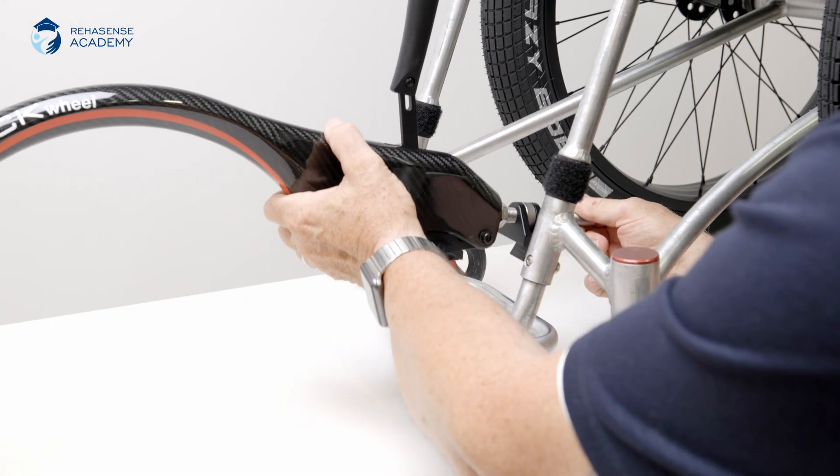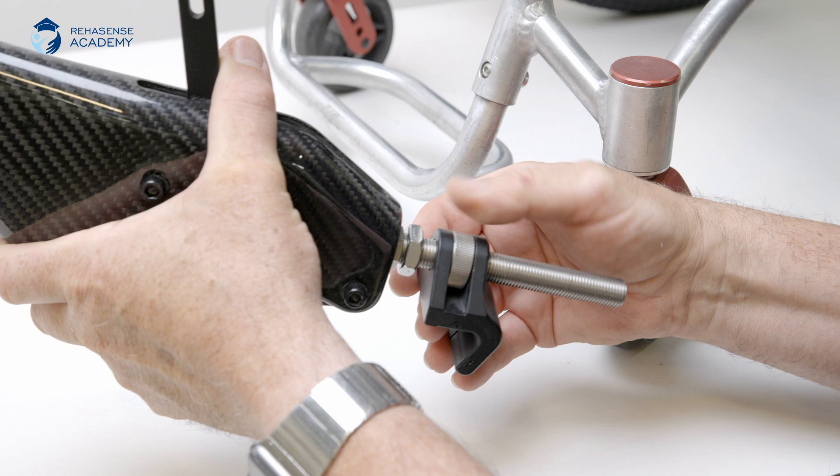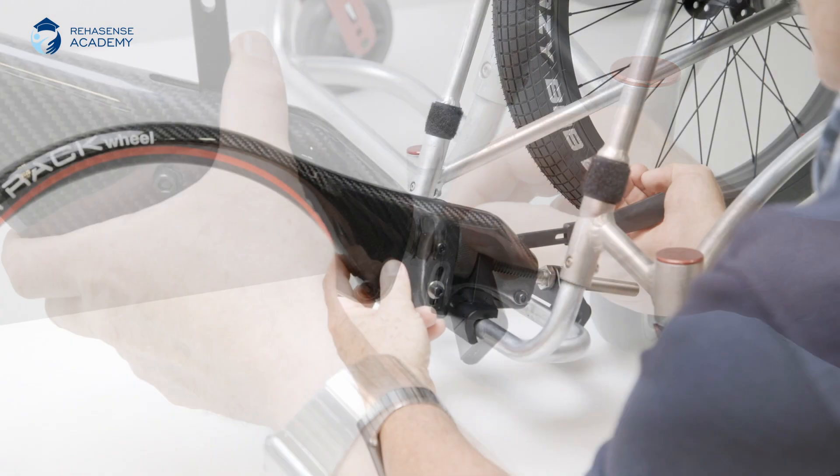As you can see on this scene, the track wheel is loose even though it's locked. Let's start by correcting this. Turn the adjustment nut until the clamp is tightly attached to the foot plate when in locked position.